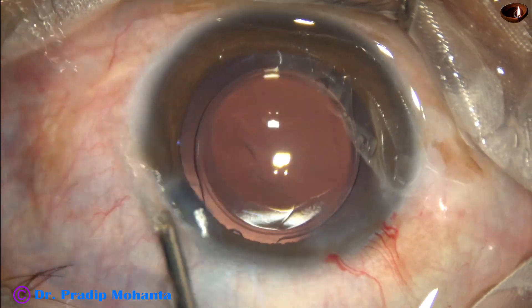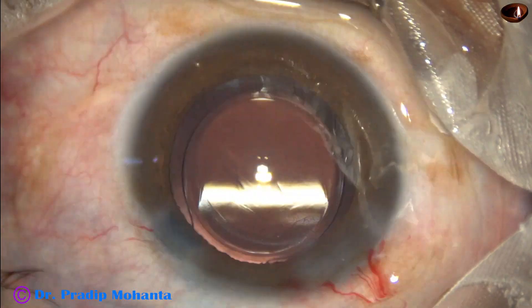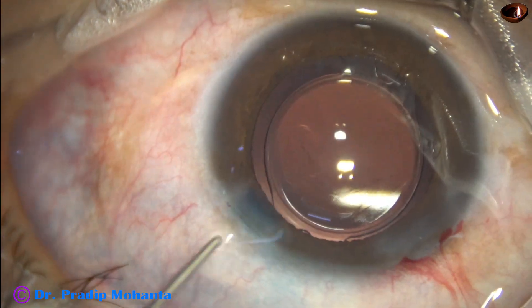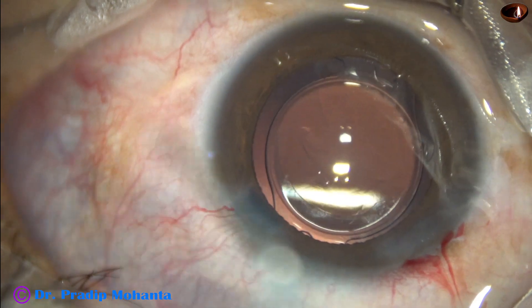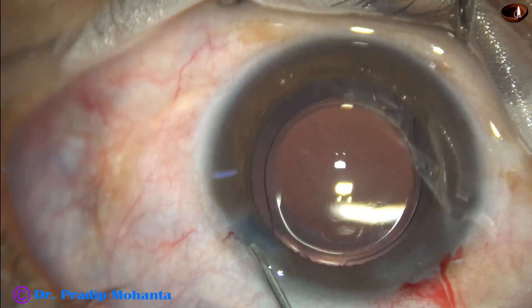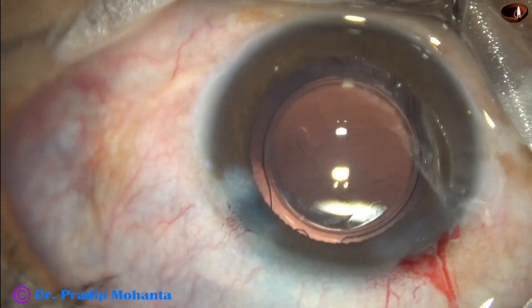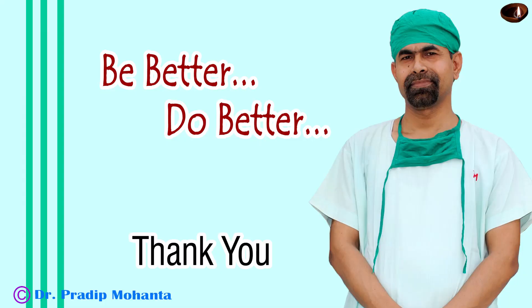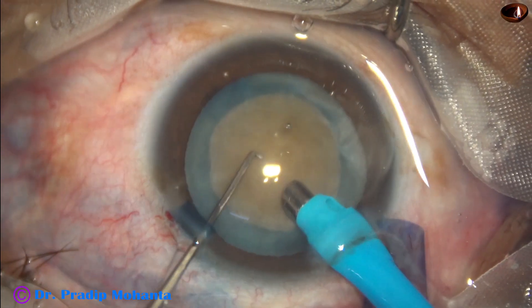Now we have to close the side ports, form the anterior chamber nicely, check the integrity of the wounds, and then conclude the case. Thank you very much for your attention. Hope this video will help you in developing your surgical skills.